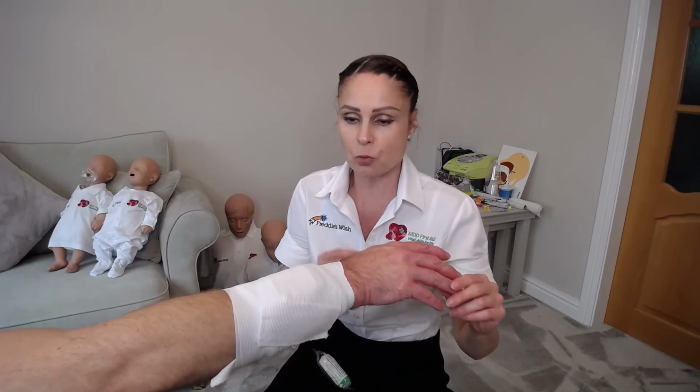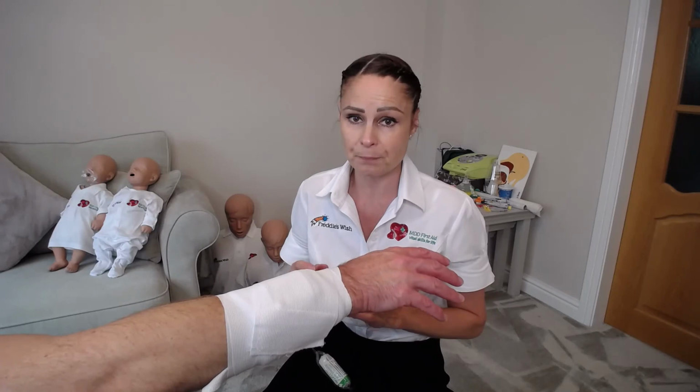Secure that in position. What you do need to be careful of with these type of pressure dressings is that you're not cutting off circulation to the lower limb, whether it be on the leg or the arm. So what you need to do is check capillary bed refill, so circulation on the hand or the foot. And these dressings are only suitable for limbs. In order to check circulation, you need to apply pressure either to the back of the hand or to the nail. But if there's acrylics or nail varnish or gels, you won't be able to do that.